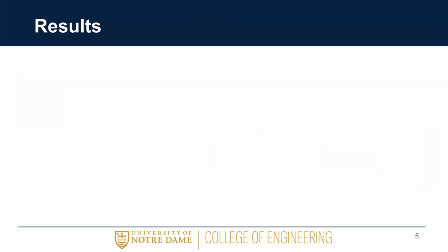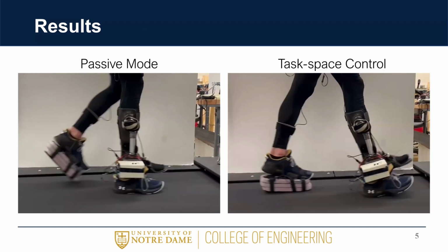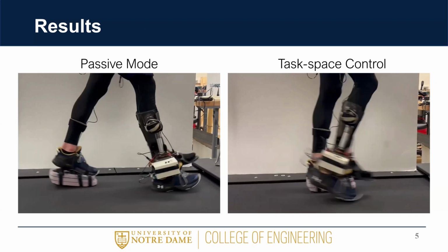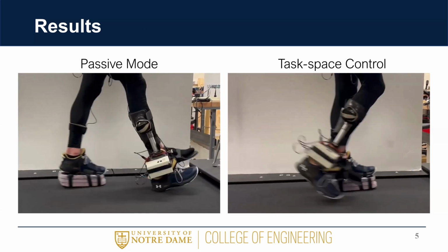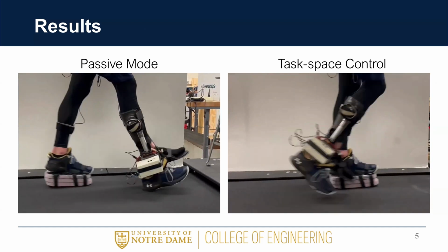This framework was tested with an able-bodied individual donning the open source ankle via a bypass adapter at their preferred walking speed. During testing, the user walked on the device when operating in passive mode, as shown on the left, and using task-based control, as shown on the right. The user walked on each controller for 60 seconds, achieving at least 40 continuous strides per controller.